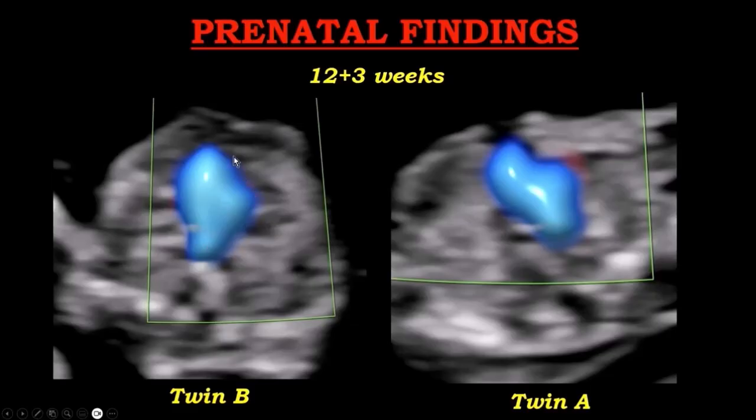If you look at the normal three vessel and trachea view, this is left, this is right, this is PA. PA should always be the most anterior vessel in the three vessel and trachea view. Here we have a kind of normal V shape on the left from the trachea, but the most anterior vessel is not the pulmonary artery. This is the pulmonary artery from left to right. It should be PA, aorta, SVC. So we can see that the aorta is way too far up front here.